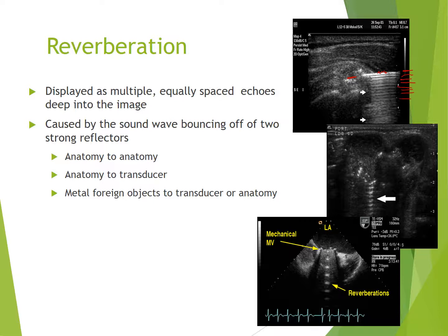You can see through this mechanical valve here on the mitral valve is again another strong reflector, and we get equally spaced reverberation artifact behind it.